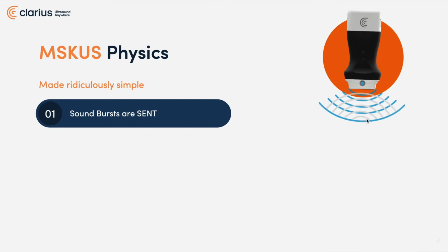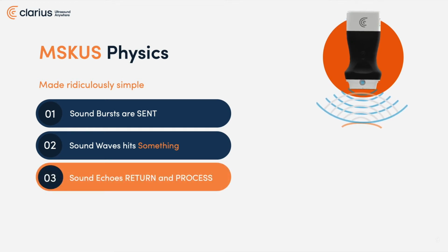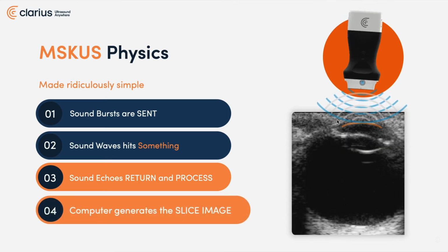They then strike something, in this case, this thing of orange, and then they ripple back, an echo. And those echoes then are processed based on time and intensity in the actual device, and then what comes from that work of magic from the engineers is an actual image that shows up on our iPhone or whatever it is we are actually sending this Wi-Fi signal to.